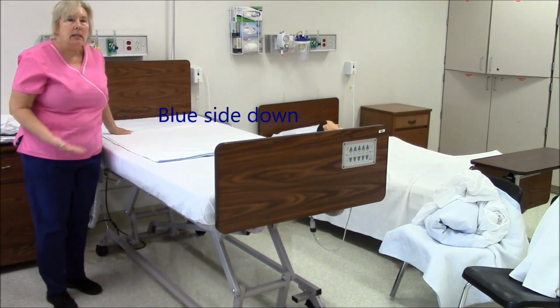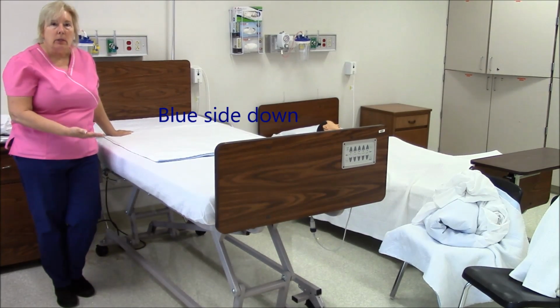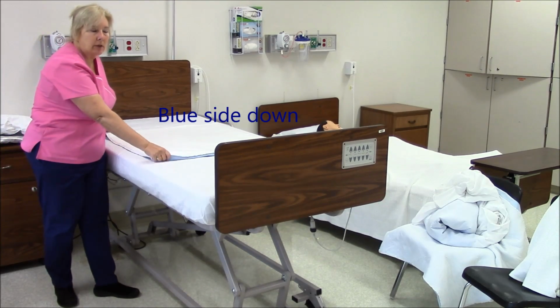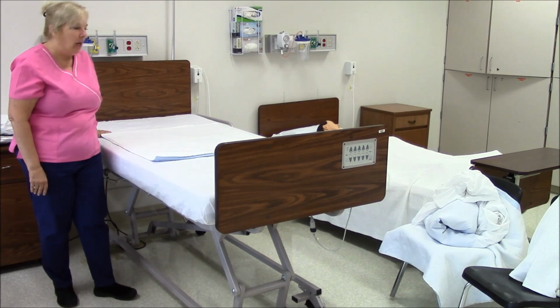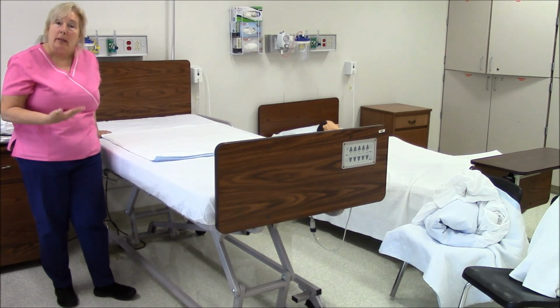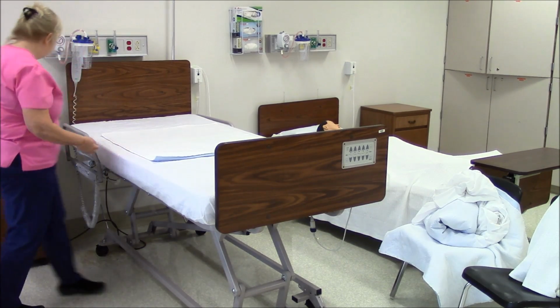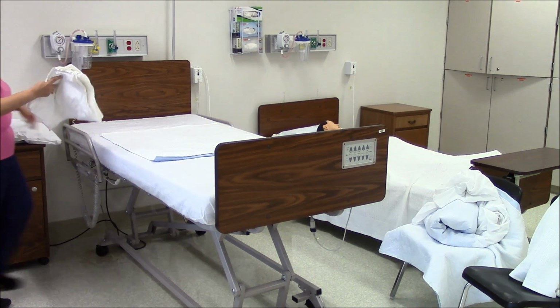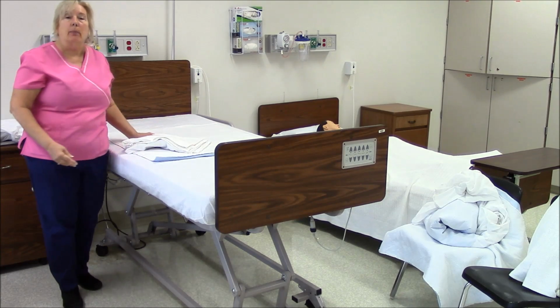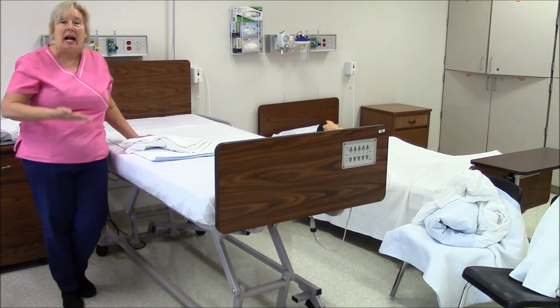The nice thing also with the bed pad is we can also use this when we have to move the patient. So the bed pad is now applied. What my next step is, I will be applying the top sheet, which again is in order. With the top sheet, it is important to put the seam side up.